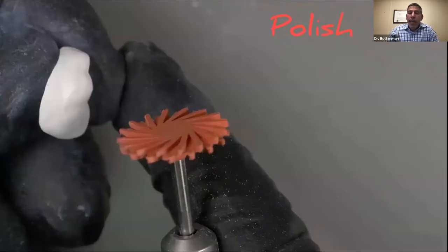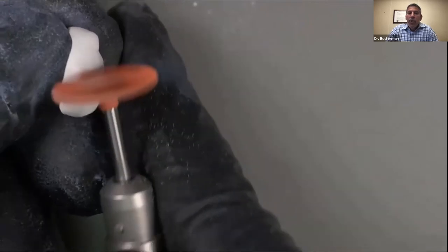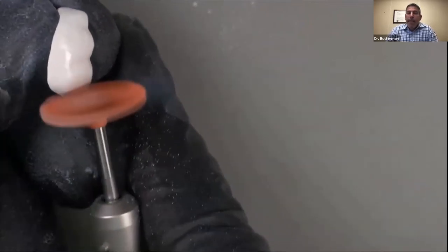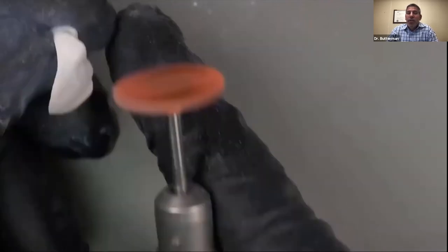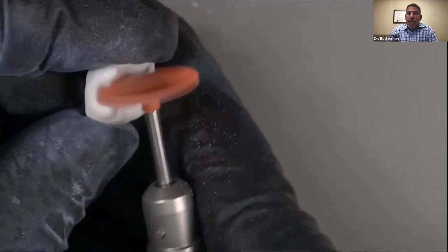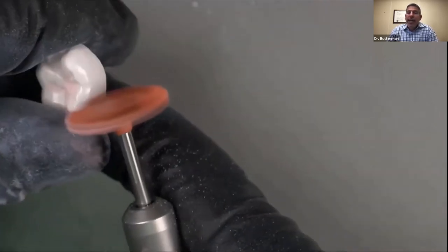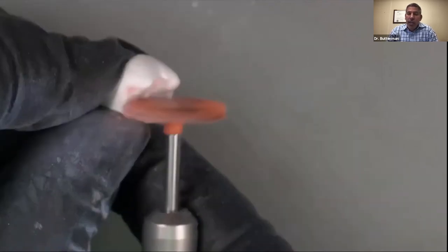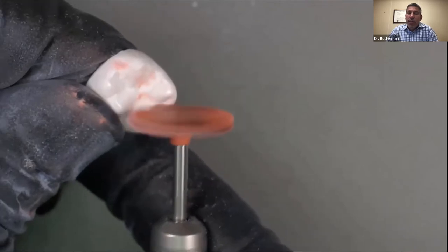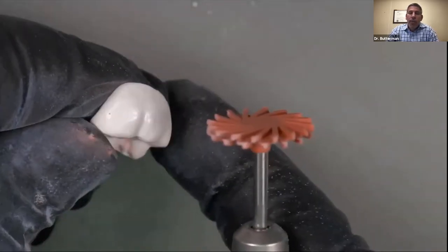Now I'm going to come through and polish it. So I'm going to use the red spiral polisher, and this one is going to now start to give it a little bit of a shine. And I've got to say, Katana is probably one of the zirconias that pre-polish better than any of the other materials that I've seen. And it really, really is quite easy to pre-polish this material. Again, I would rather not touch the contacts with this. You probably could, but I just don't want to take any chance of opening it up. So I'm just going over the same surfaces that I did with the blue spiral polishers.